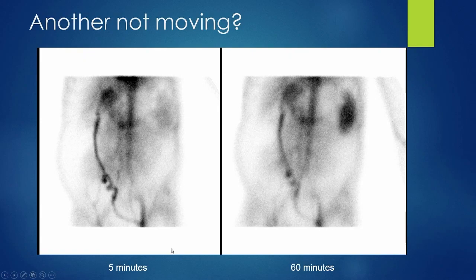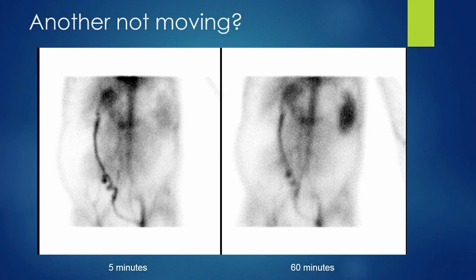Here's another image of activity not moving — from five minutes to 60 minutes the activity doesn't move at all, which is very unusual. SPECT CT and additional data again help clarify — there's ascites, bowel squished in the middle, and the activity links up to the vasculature and goes to the liver. In this cirrhotic patient, a notable collateral from the left iliac or possibly femoral artery leads all the way to the liver, likely going in near the caudate lobe, which shows more activity than expected.